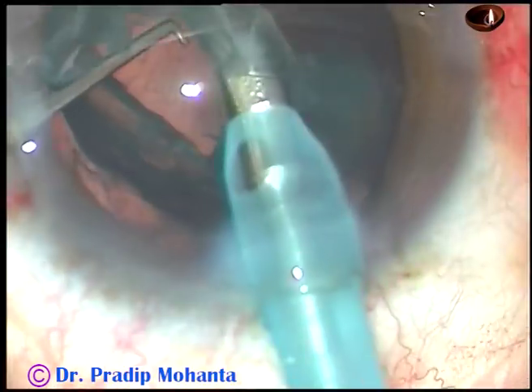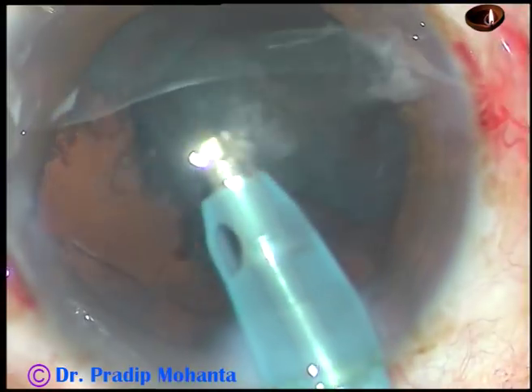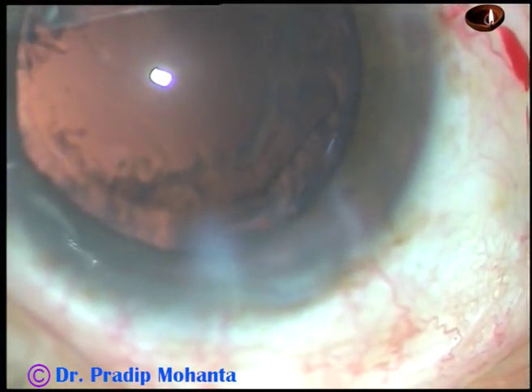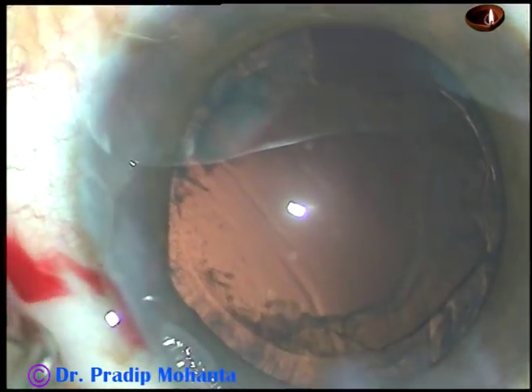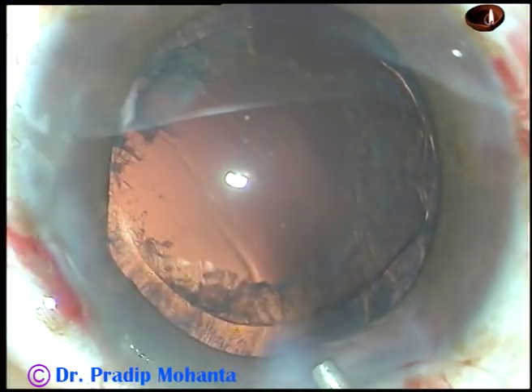Now I pull the epinucleus with vacuum, and I find that there is no posterior capsular rent. So this was a posterior subcapsular cataract, not a posterior polar cataract.